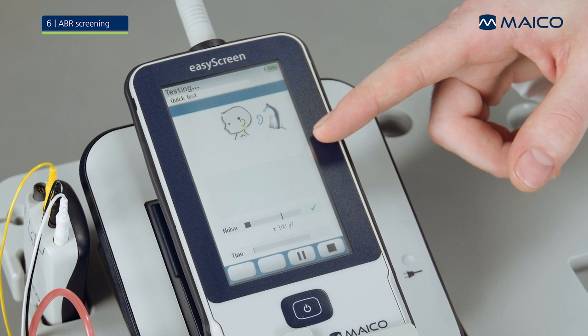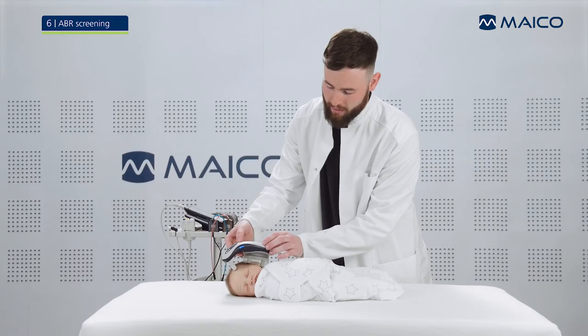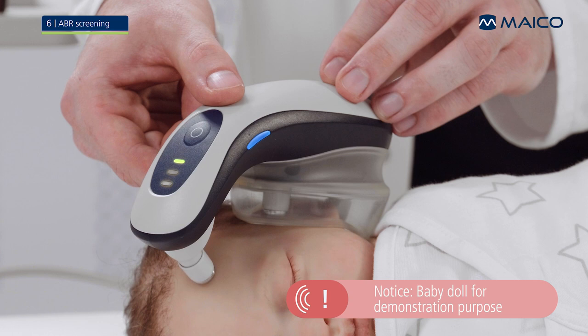You can monitor the disturbing noise on the EasyScreen. During the measurement, make sure that you do not apply any pressure to the baby's head. The three status LEDs on the Baraphone will show you how the test is progressing. A single green LED means the test is progressing well. Orange LEDs indicate that you might need to take some action to improve test quality.